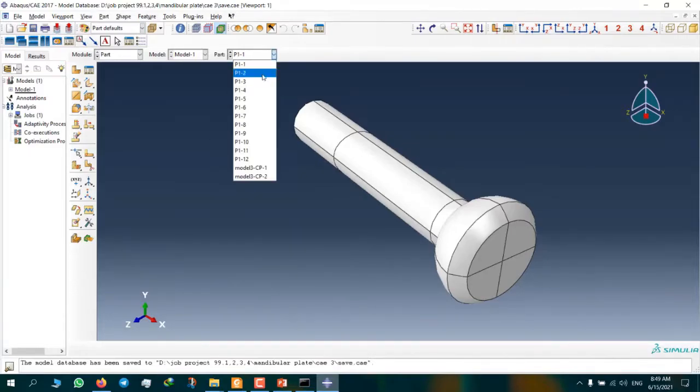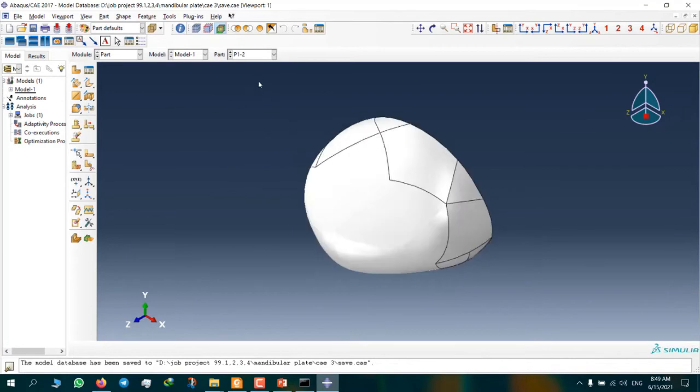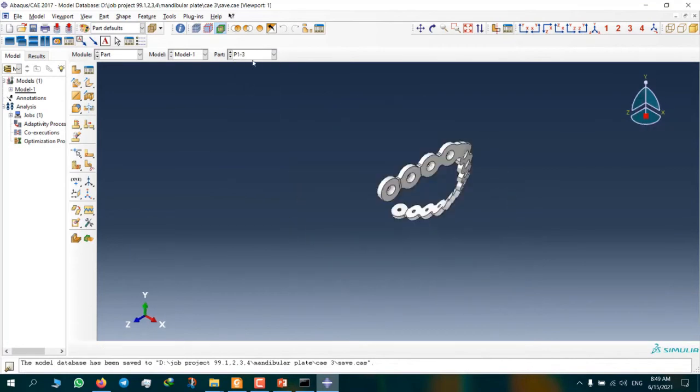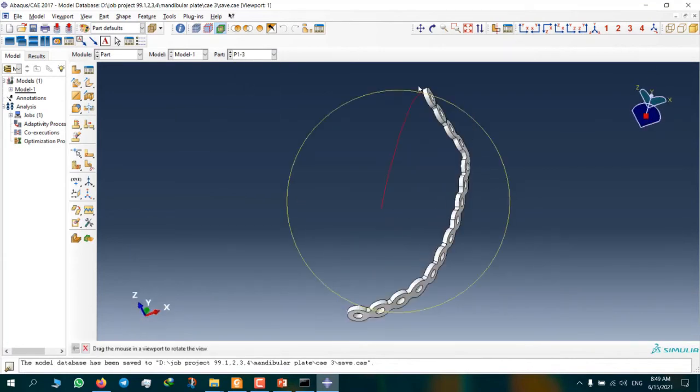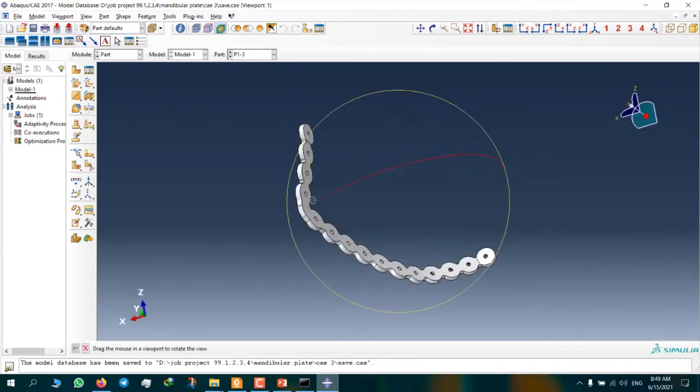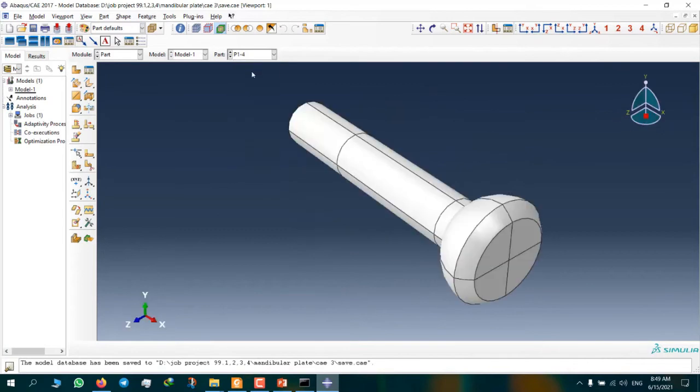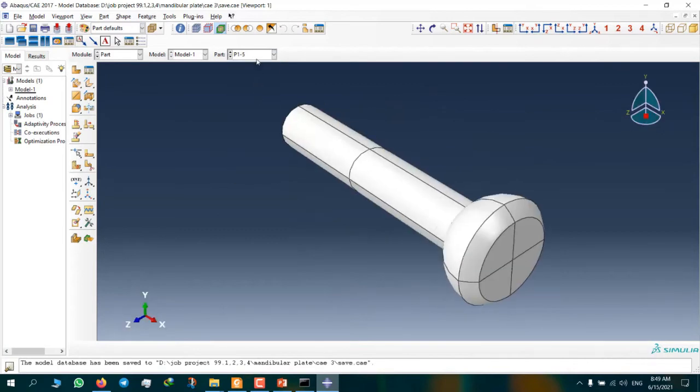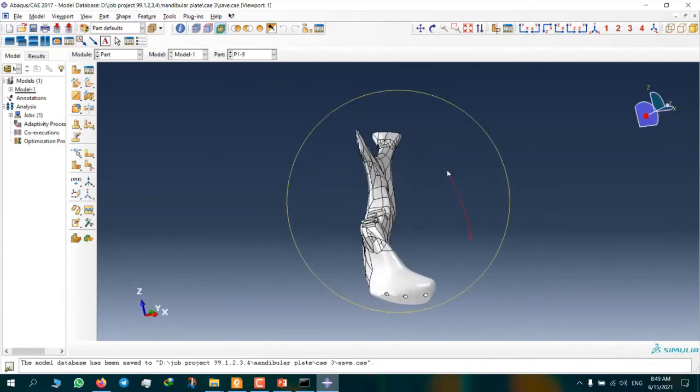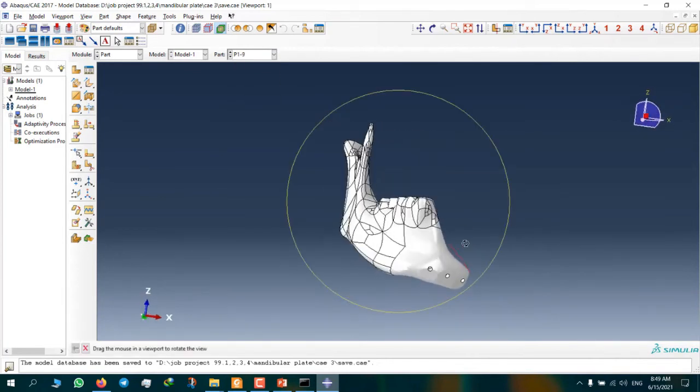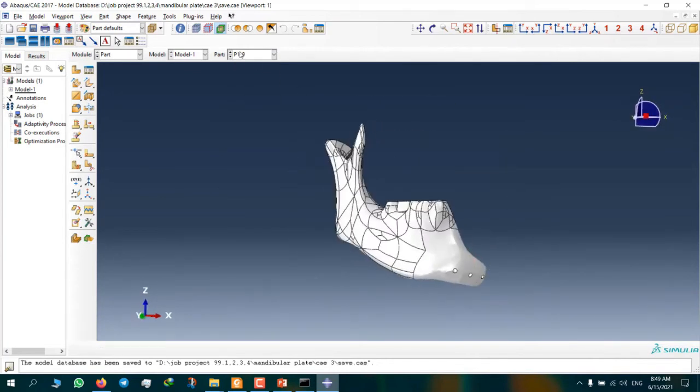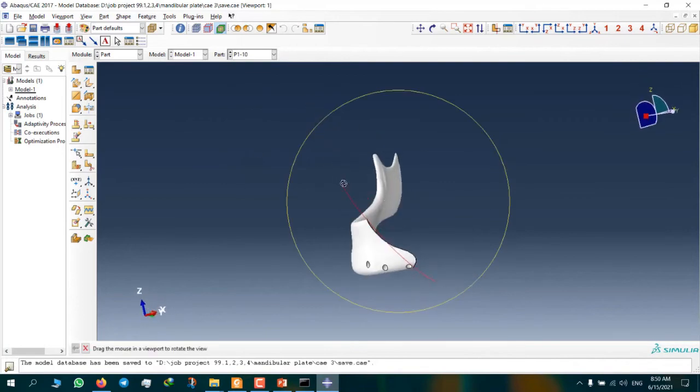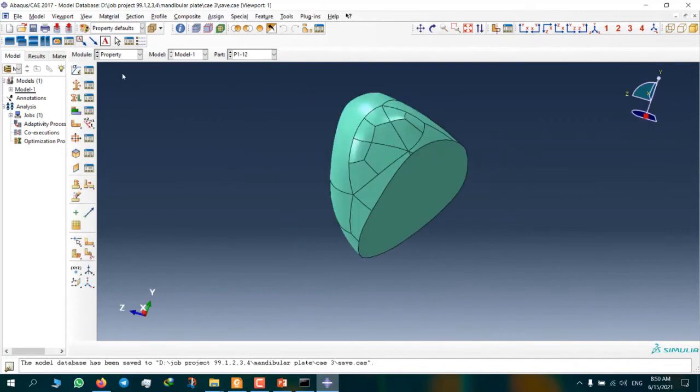This is our model. This is a bone, this is a mandibular plate, this is a screw, an orthopedic screw, this is a mandibular bone, and this is a spongy bone.